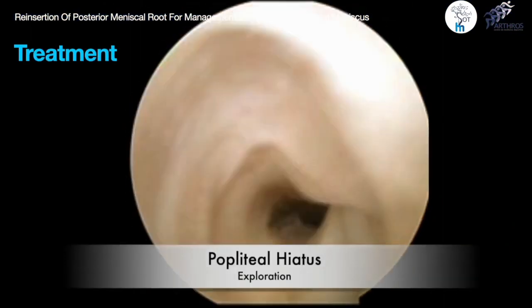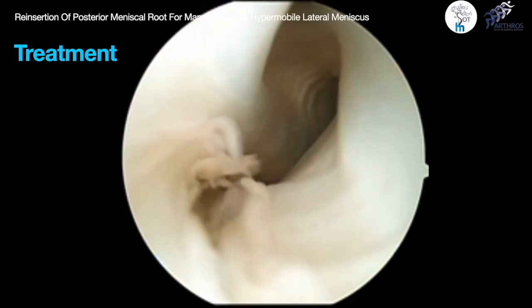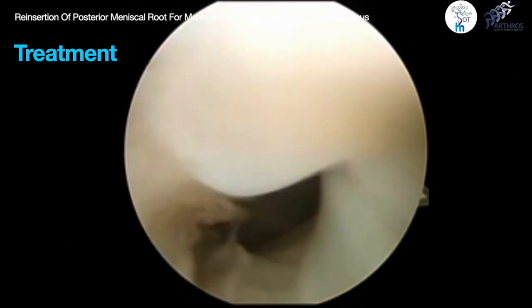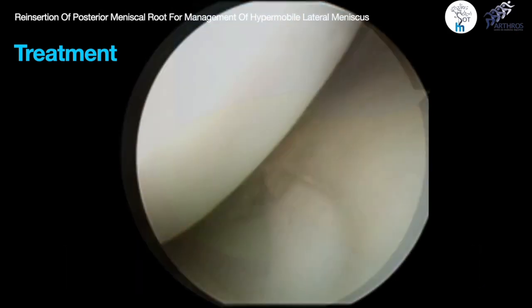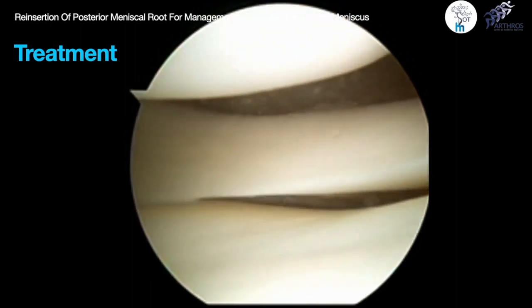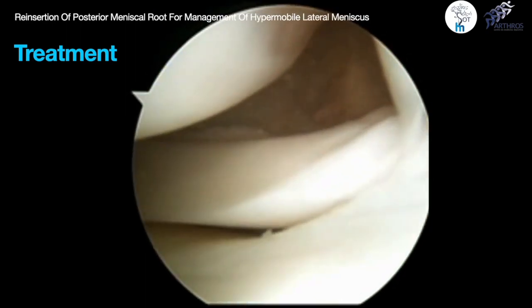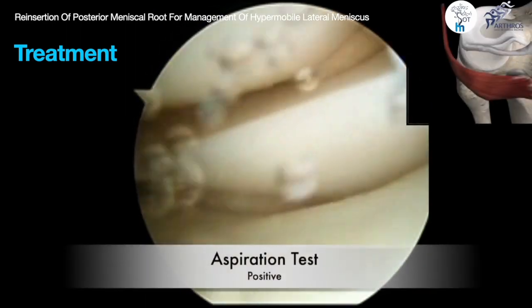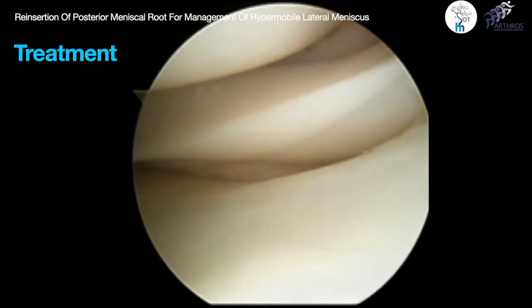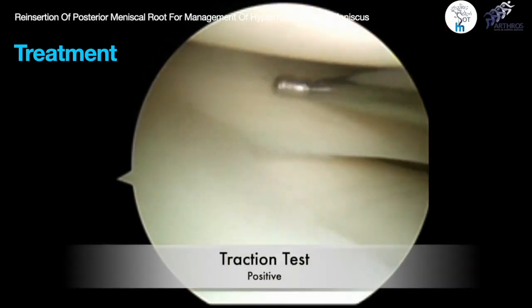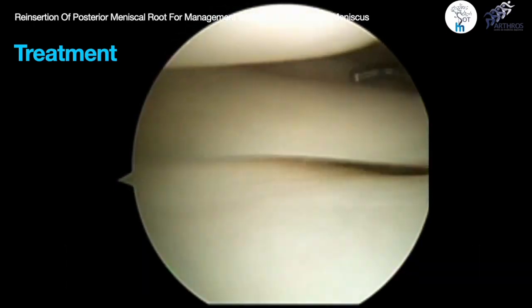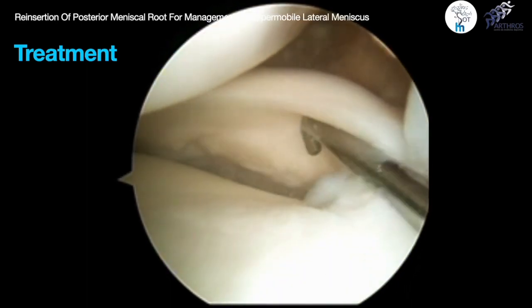In arthroscopy, we start by exploring the popliteal hiatus to visualize the popliteus tendon and the three fascicles. After exploring the medial compartment to rule out other pathologies, in the lateral compartment we can see a positive aspiration test, a positive traction test with the arthroscope, and cephalic laxity of the posterior root without disinsertion.